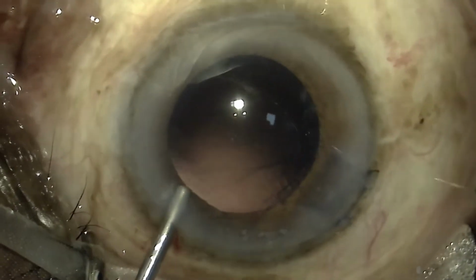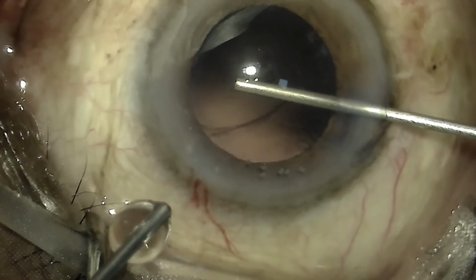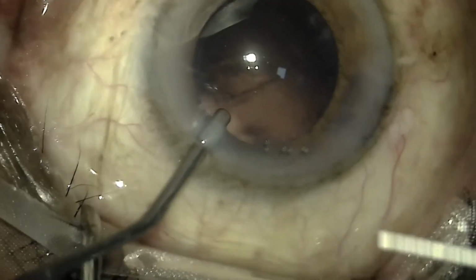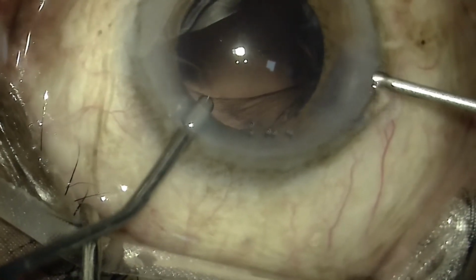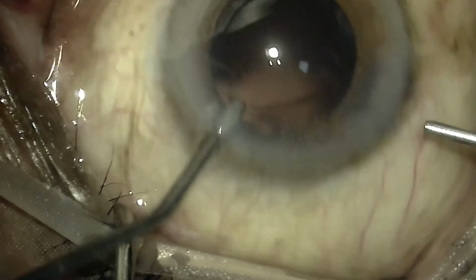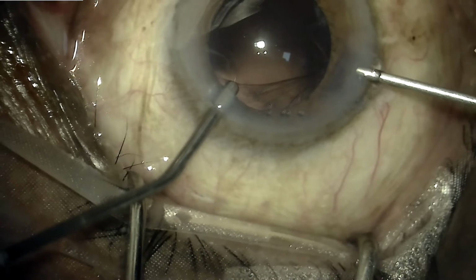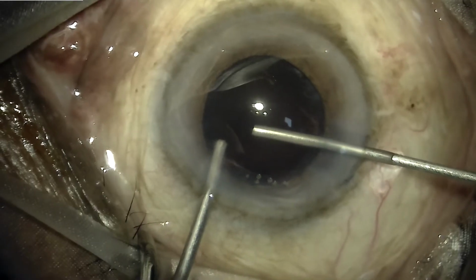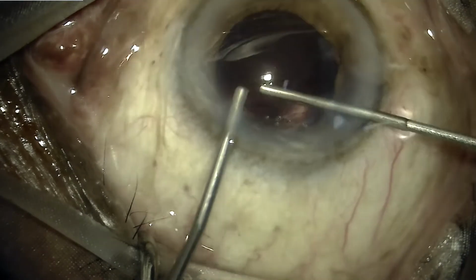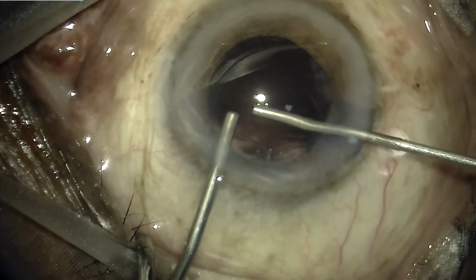Now we can see the PC rent usually will extend once we are coming out, and this is because vitreous is more or less like a conical shape with a broad base inside and the apex pointing out towards the wound, and this is why the PC tear will usually extend. But once the vitreous is being taken care of, you can appreciate that the tear will appear smaller. It is because the tear is not extended, it is just being stretched due to the presence of vitreous.